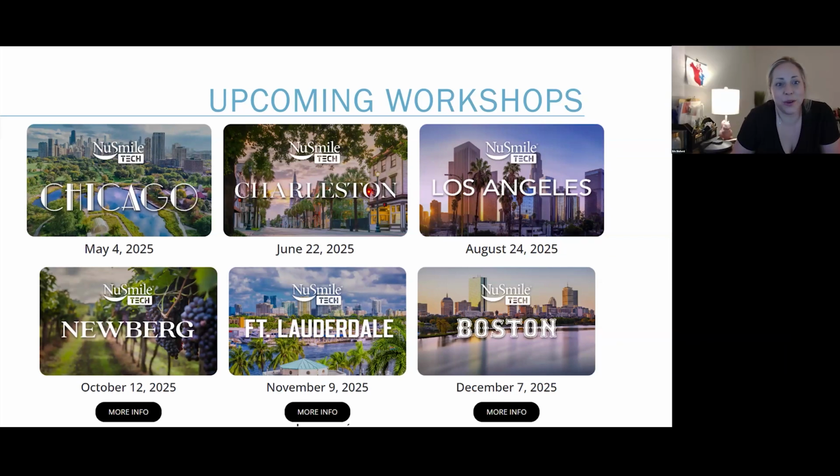As far as we know, we have not had needle breakage. We've had a few issues of the hub separating, and that was from doctors admittedly going into different quadrants with the same needle. They were screwing it in and unscrewing it, then going into the next quadrant and twisting it in and untwisting it, and they unscrewed the needle from the hub, and then it was sitting in the bone, but then you just pull it out.